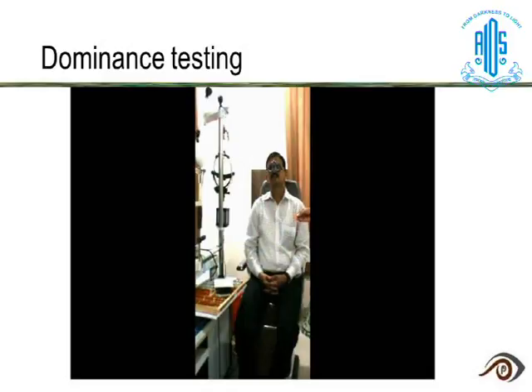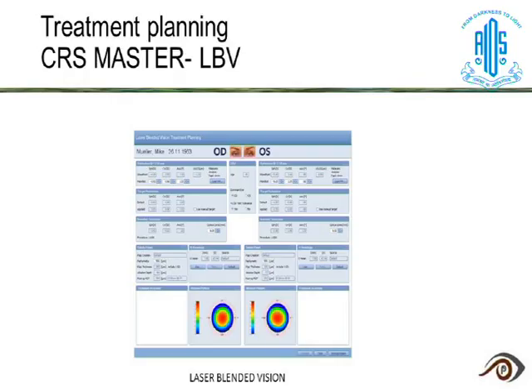The other thing is, the patient should not be aware. This is similar to a monovision test. When putting the plus 1.5 on the non-dominant eye, you can occlude his vision from the vision chart. You can just come in the way and do it, or do it when the patient is looking at the near chart, so they will not realize what you have done. So after you put the distance correction, also show them the near chart. See, can you read? So they won't be able to read, and that is when they actually realize that, okay, one eye has to get blurred for me to read clear. Otherwise, they will not understand if we just tell them that.